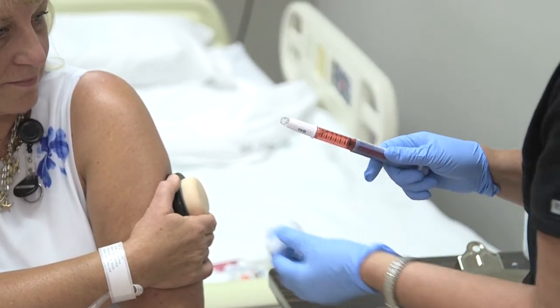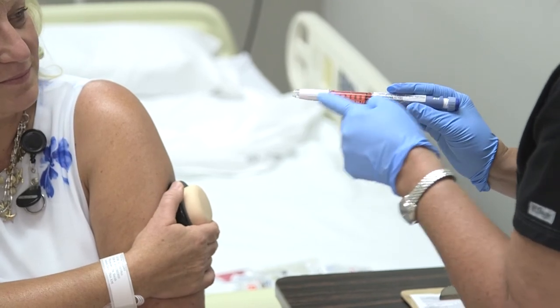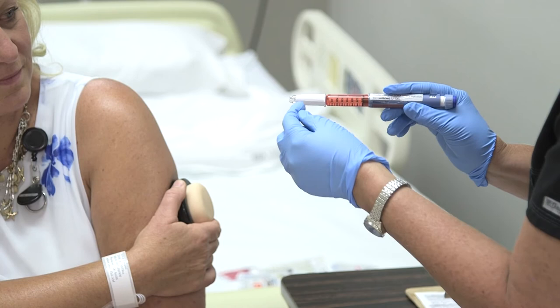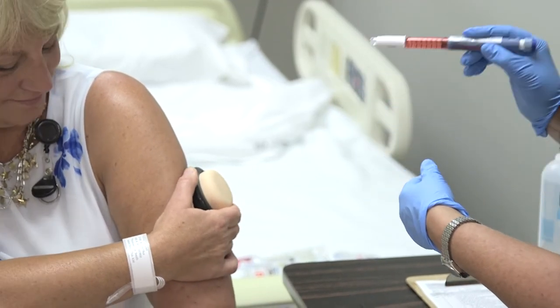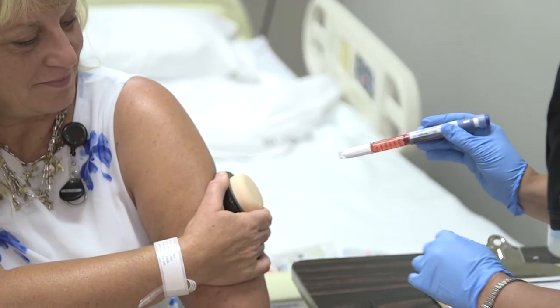Pens are really useful once you get the hang of them. One important thing to note: once you insert the pen into the skin, the clear part on the end will push back and engage a spring inside. This allows you to push the medication through. You want to hear that click before you go ahead and inject.